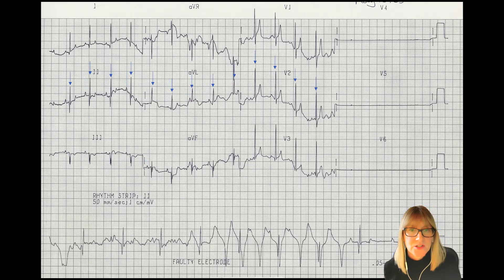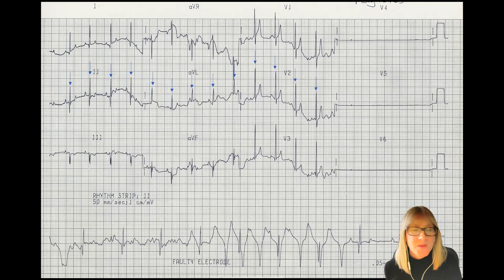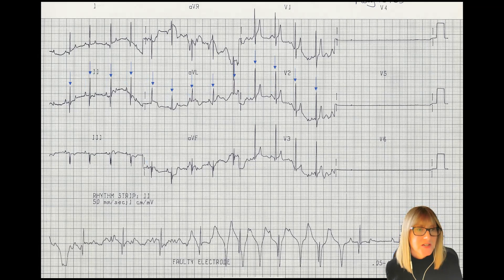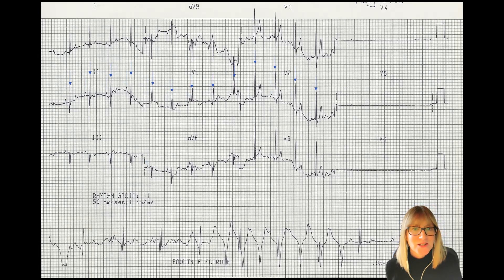Of course, they change as the lead changes as we move from left to right. The PR intervals look like this activity is associated, and the P's are positive in lead two. So I really do quickly think that this looks like a normal sinus rhythm, at least in that top section.